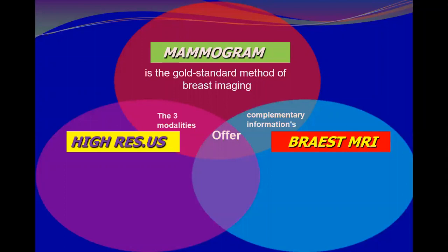As you know, mammogram is a gold standard method of breast imaging, and by the grace of God we complete the course of mammography, and today we are going to start high resolution breast ultrasound.